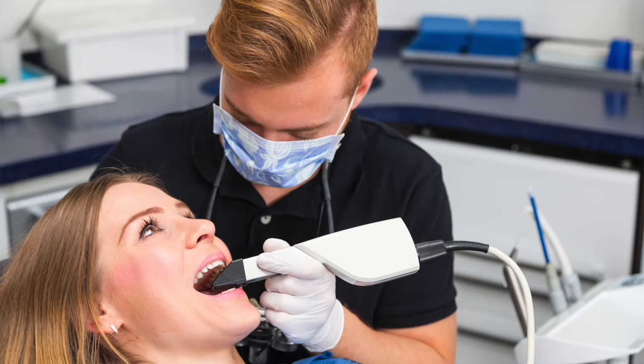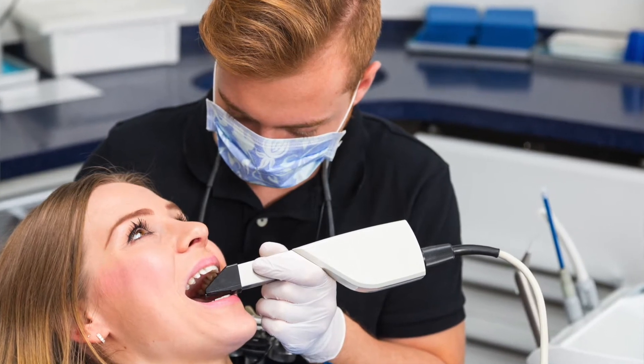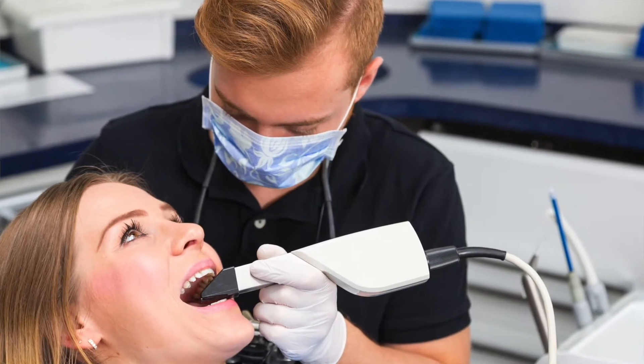If you have any questions about this process be sure to ask, and we can cover that more later. For this exercise, since the model is already prepped, we will not be using a biocopy catalog. Now that we are oriented to the screen, let's talk about some scanning considerations. When doing a scan on the actual patient, the teeth should remain dry during the scanning process.